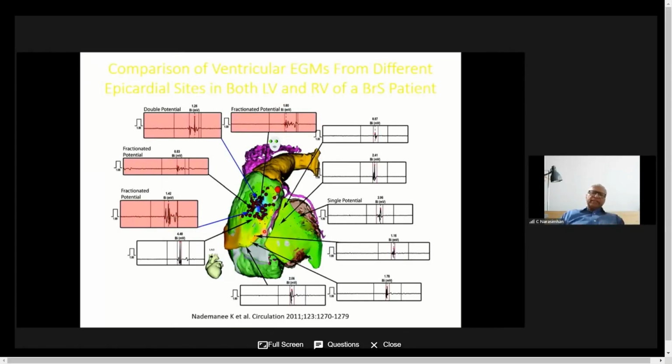The other thing, after catheter ablation is successful, is that we instill a little warm saline in the pericardium, because as you know, the Ito current of Brugada syndrome is highly temperature sensitive. So if you instill warm saline in the pericardium, and you have left any substrate unablated, it will become more manifest. But if you have completely ablated the Brugada substrate, you will find no ST segment elevation. At the end of the procedure, we always use this to validate that we have successfully ablated a Brugada.